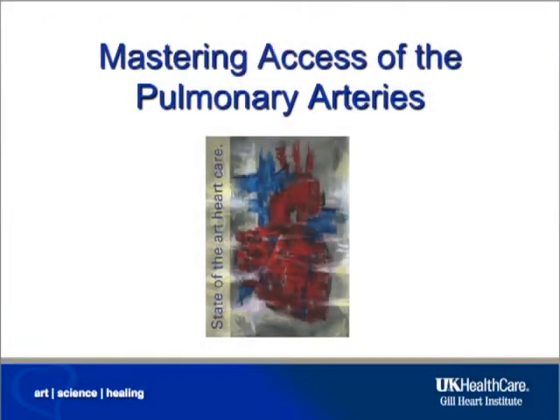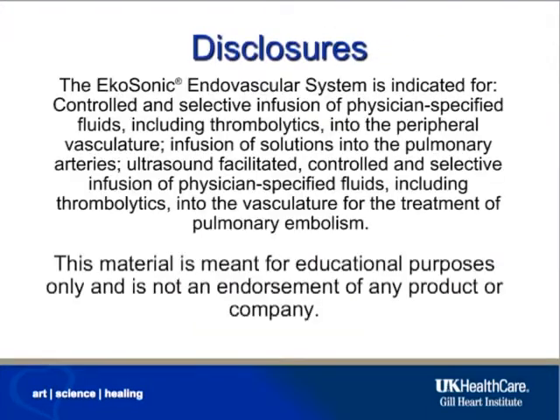Access of the pulmonary arteries is a standard technique that is used for multiple diagnostic and therapeutic purposes. We will discuss the tips and tricks for accessing the pulmonary arteries in this section.